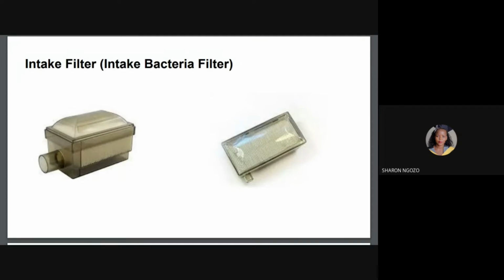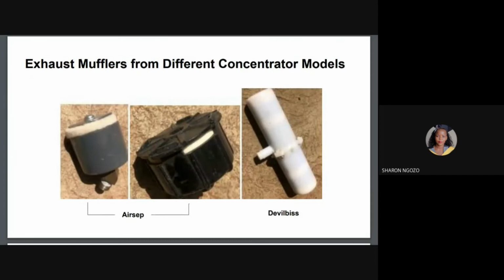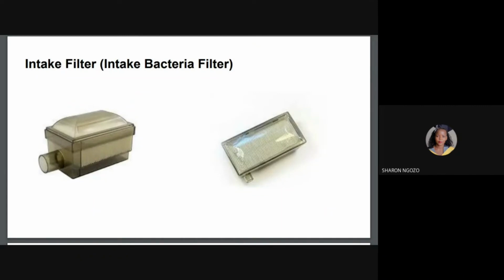In most concentrators, the intake filter is a HEPA filter, which stands for high efficiency particulate air filter. These are the hardest working filters of them all. It will spend an entire year scrubbing all the microscopic dust out of the air that we cannot even see with our eyes. The longer you run your machine, you may notice that the white pleated filter material inside is becoming dirty looking. This is normal. It means that the filter is doing its job. Stopping the dust from entering your machine will absolutely help prolong the operating life of the machine.